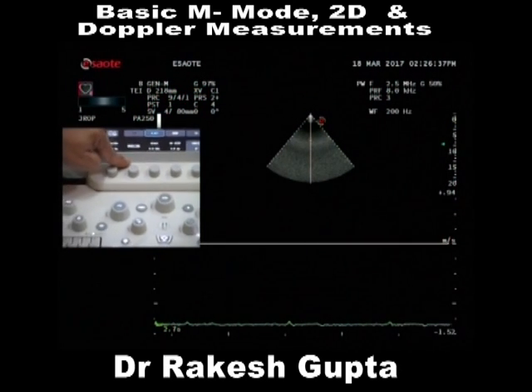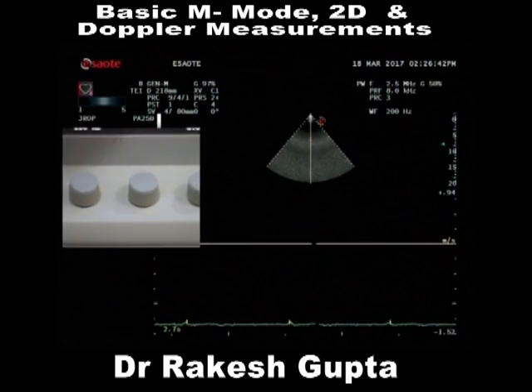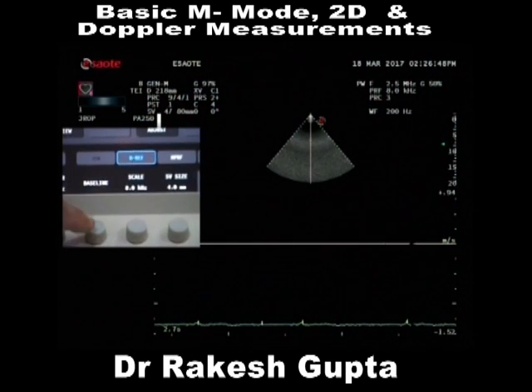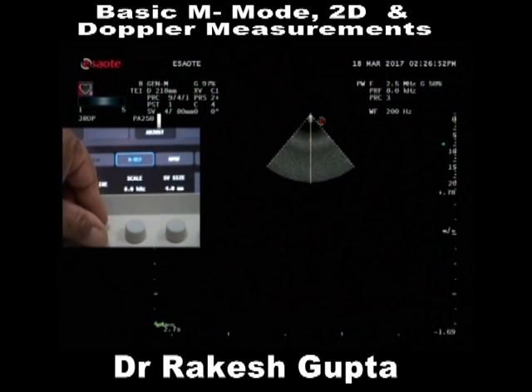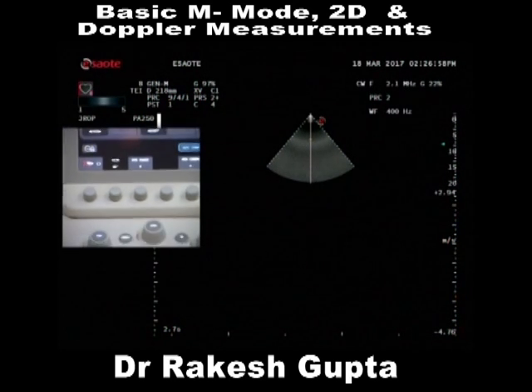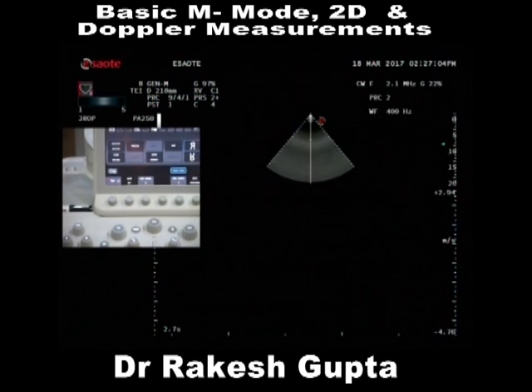How does the baseline go up? Now focus on this. Now look at this word written, baseline, over here, and here is a knob. With this knob, I have moved my baseline up and down. Correct? Same way, if I switch on my continuous wave Doppler, look at the velocity: it's 2.94 and 4.76 meters per second.